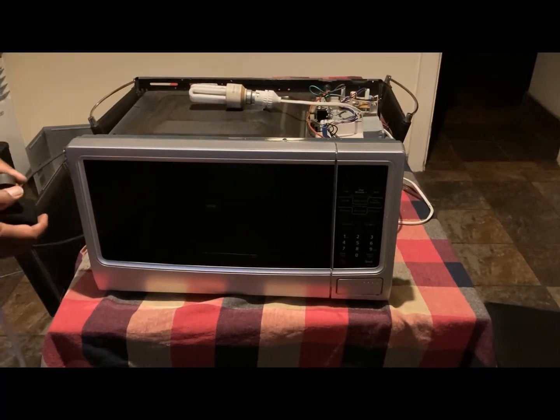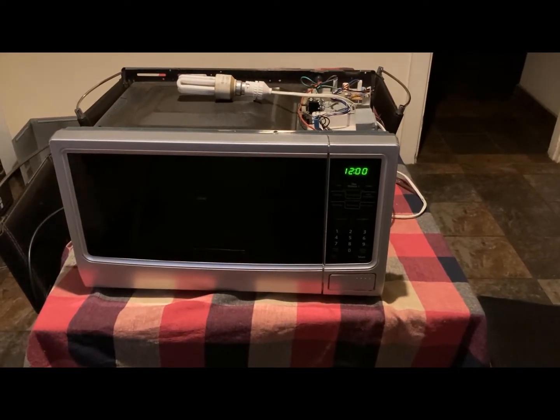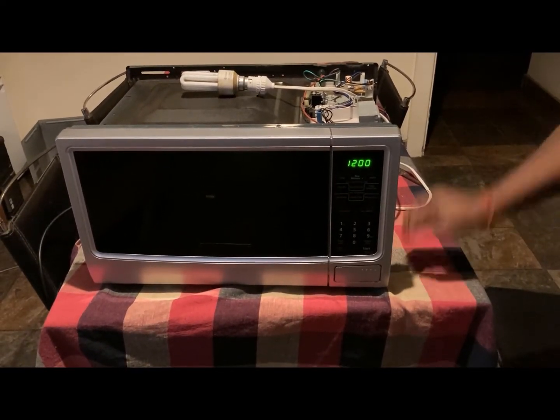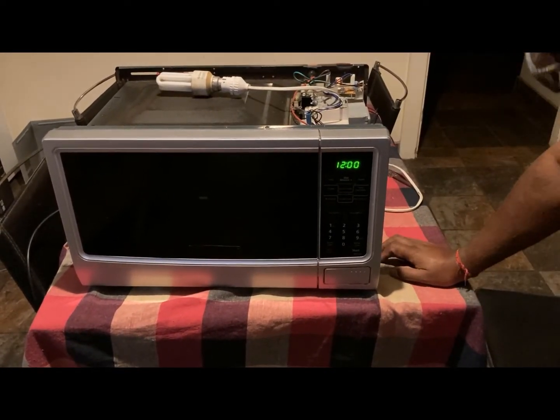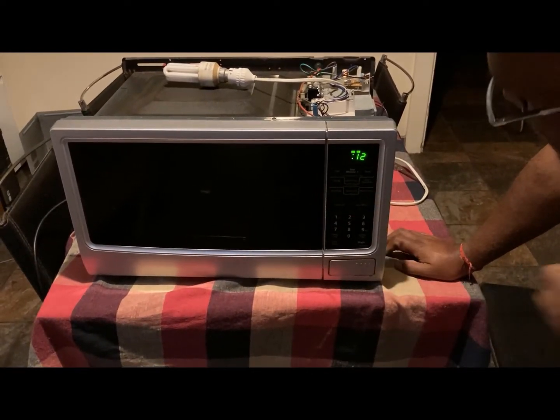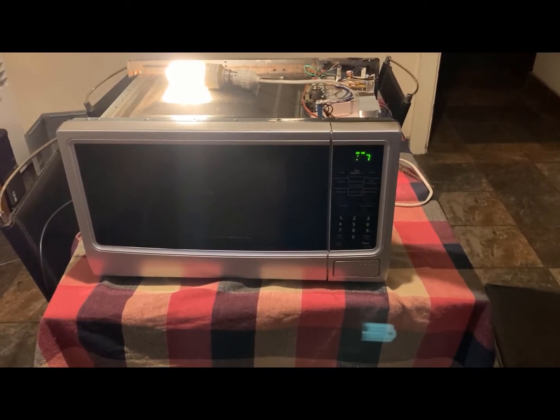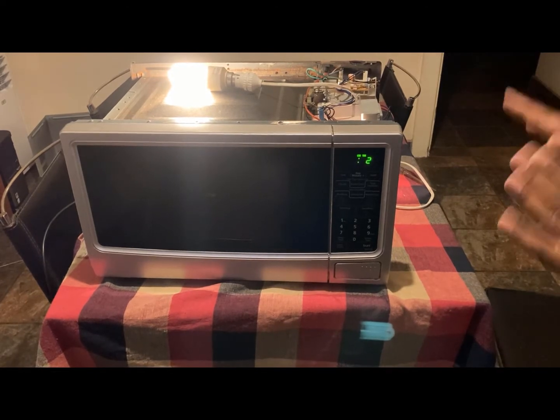Now I'm going to energize this box. I can't call it a microwave, it's not a microwave anymore. So this will be my future sanitizer box, and with this temporary lamp, I'm going to see if it will really do the trick that I want. So I'm going to put 12 seconds, and I'm going to press start, and this globe needs to go on. That means perfect.